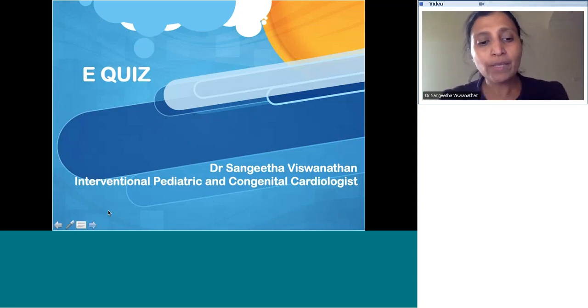So today we'll be having a quiz with some echoes and angios and case scenarios. It's very important that you interact and try and answer the questions, and that's what makes the quiz interesting and informative. Okay. So let's start.